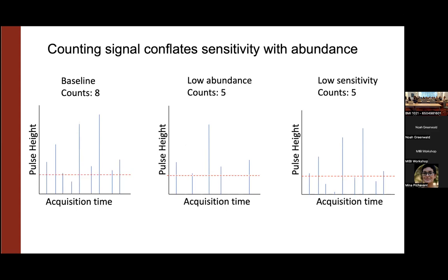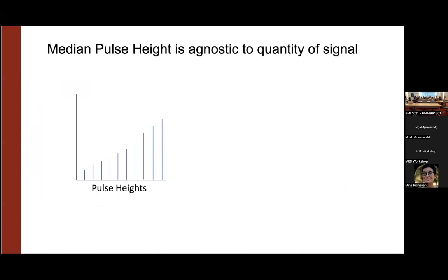So with this setup, you can see what we've decided is the actual way to measure this, which is we just directly look at the height of these pulses, and that should give us an intuitive way of understanding what the sensitivity of the detector is.